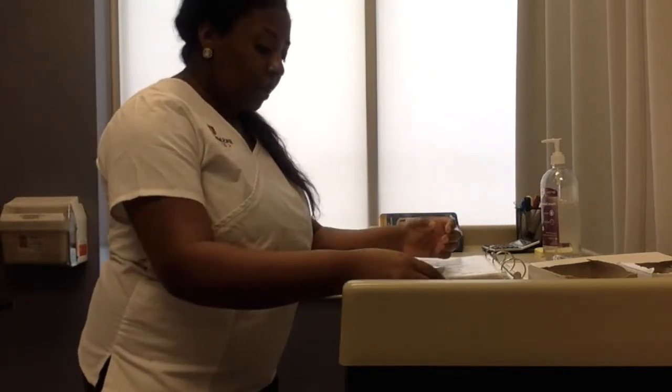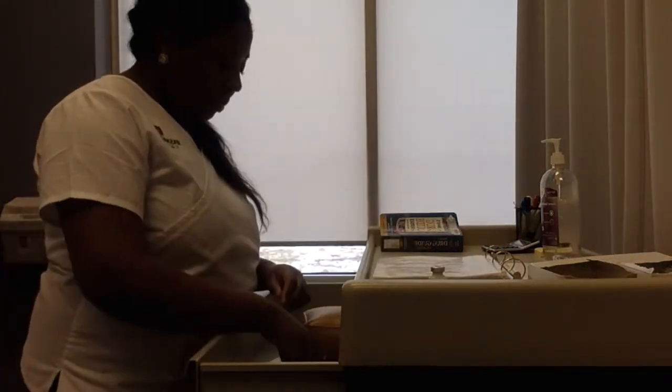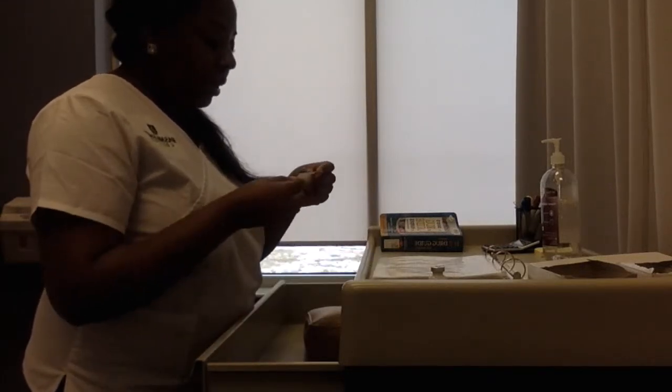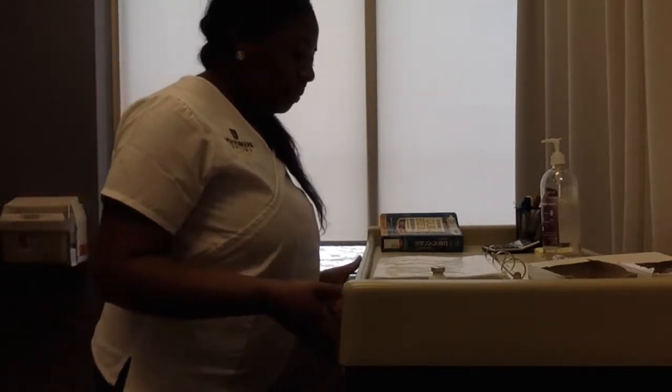Okay. From there, I want to gather my supplies. My alcohol pad, a syringe, and my needle, a 23 gauge needle with a 1 inch, since it is an intramuscular injection.